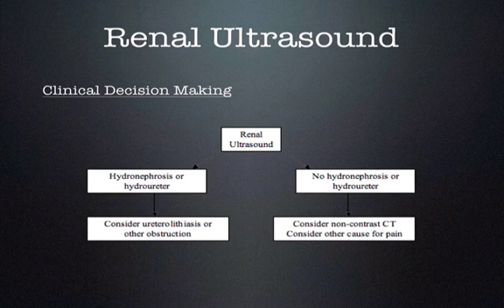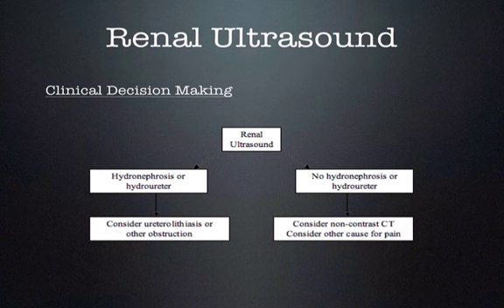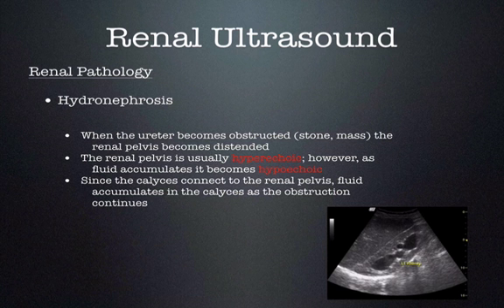The clinical treatment and workup for flank pain depends on several factors, with the new onset of pain, signs of infection, prolonged periods of pain, and increasing age being the most concerning findings. Given that ultrasound does not expose a patient to any radiation, it makes sense to utilize it as the primary modality in the evaluation of undifferentiated flank pain. By evaluating for the presence or absence of hydronephrosis, it can steer the medical management into the appropriate direction. In patients that are well hydrated and aren't presenting in the acute period, the absence of hydronephrosis essentially rules out an obstructive process.